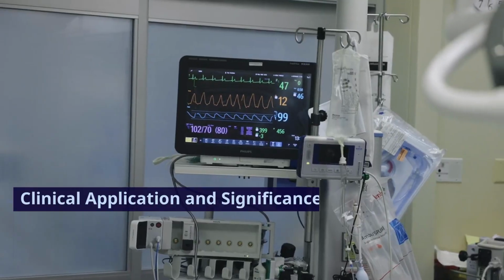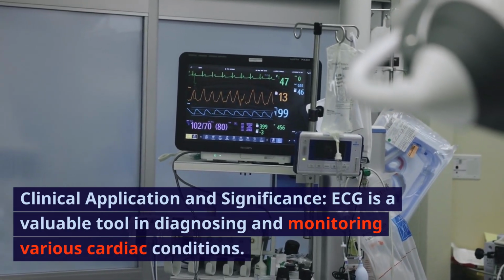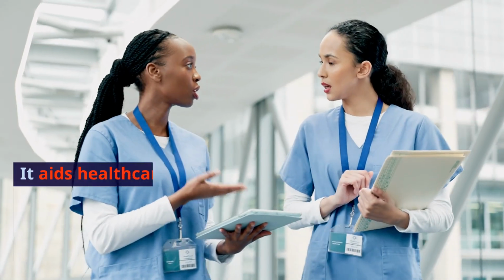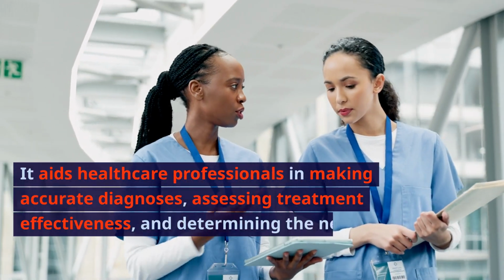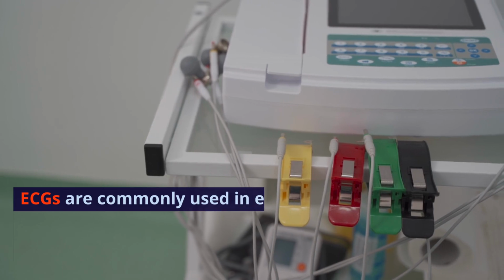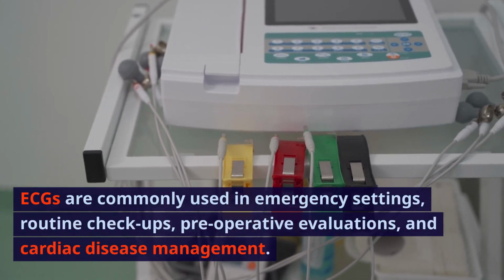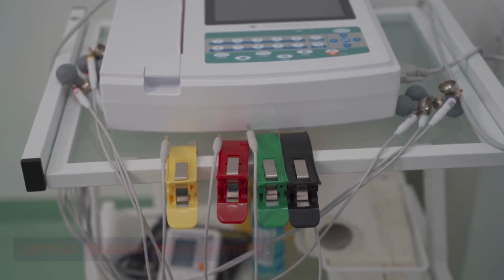Clinical application and significance. ECG is a valuable tool in diagnosing and monitoring various cardiac conditions. It aids healthcare professionals in making accurate diagnoses, assessing treatment effectiveness, and determining the need for further interventions. ECGs are commonly used in emergency settings, routine checkups, preoperative evaluations, and cardiac disease management.